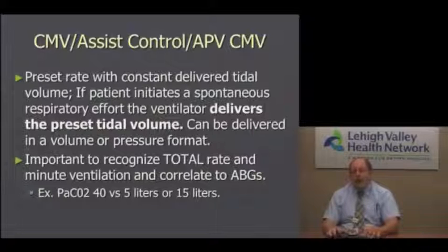So when you're looking at blood gases, even though the blood gas may be good, if the patient's cost of breathing is high, then you know there is some pulmonary physiology going on. This is what I tell the residents a lot of times. Residents will say, well, look, the patient has a blood gas 7.40, 40, PO2s, whatever. And they'll say that they're doing well. And you look at the patient at bedside, and they're breathing 35 times a minute. They're all over the bed. They're using accessory muscles. They have paradoxical breathing. So the values themselves have to be taken in context with the cost of breathing.